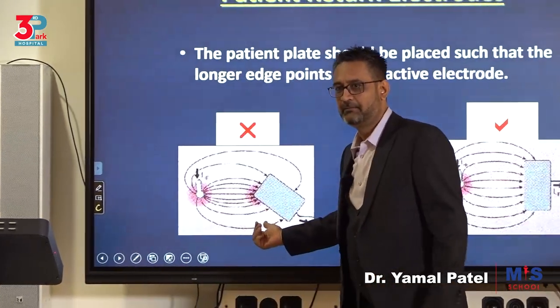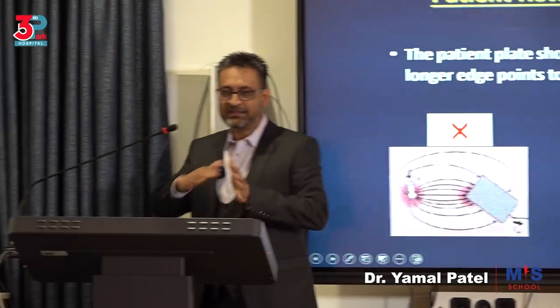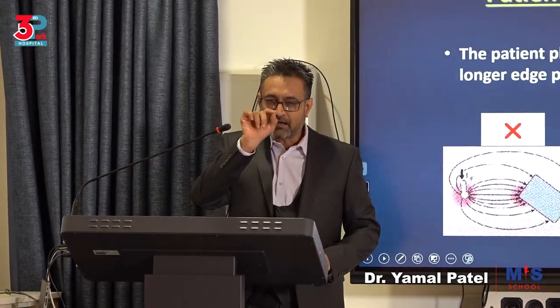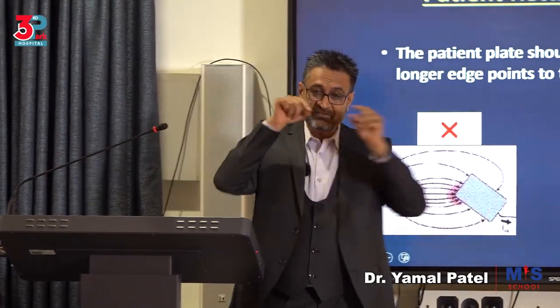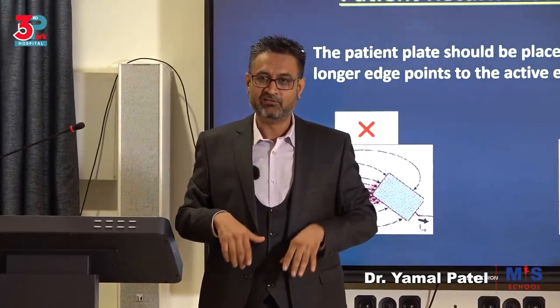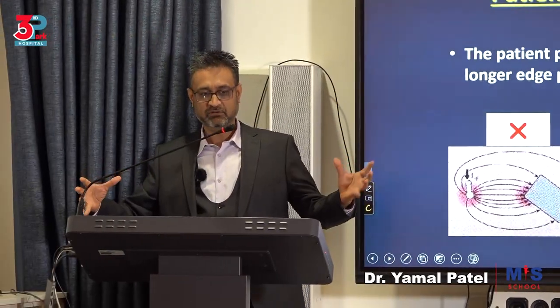It was the placement. You've understood. So simple things, simple things. Do not put it at an angle because you don't want a fine in and a fine out scenario. You've understood what I'm saying? Whenever it's fine in, it burns. So if you give them a fine out scenario, it will burn. Give it a broad out, okay? And it will never burn.